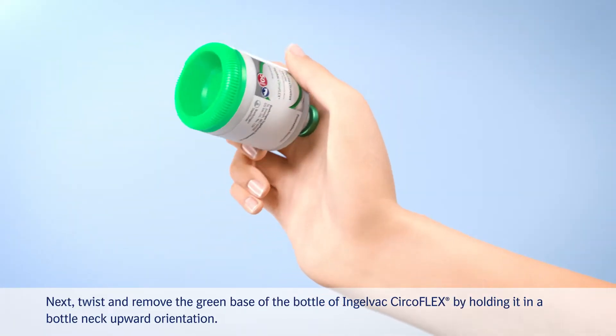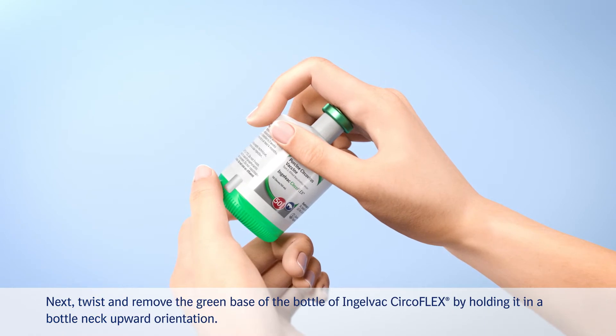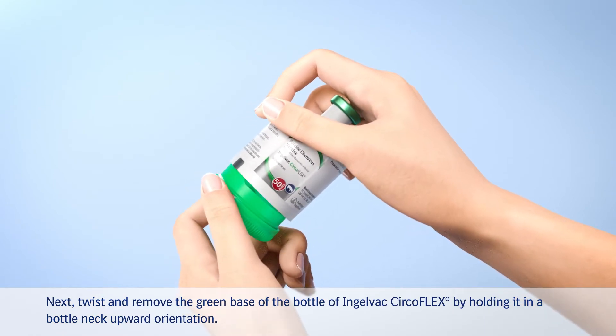Next, twist and remove the green base of the bottle of Ingelwack CircoFlex by holding it in a bottleneck upward orientation.